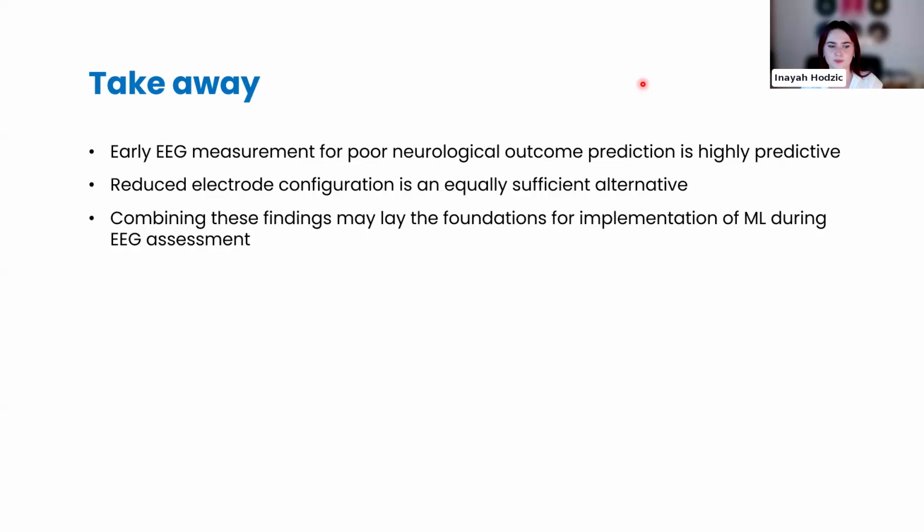So it was a choice to see if the integrity of the raw EEG signal was good enough to lead to accurate predictions. But that's certainly something that can be further researched, and it would be very interesting to see if any other representations of the EEG signal could lead to even better performance. So I hope that answered it to an extent.